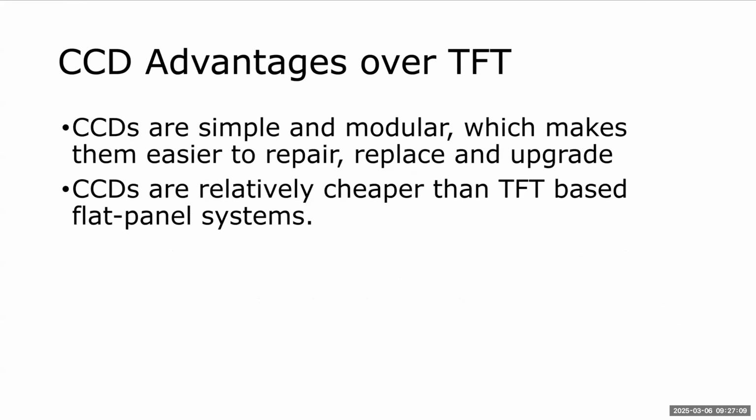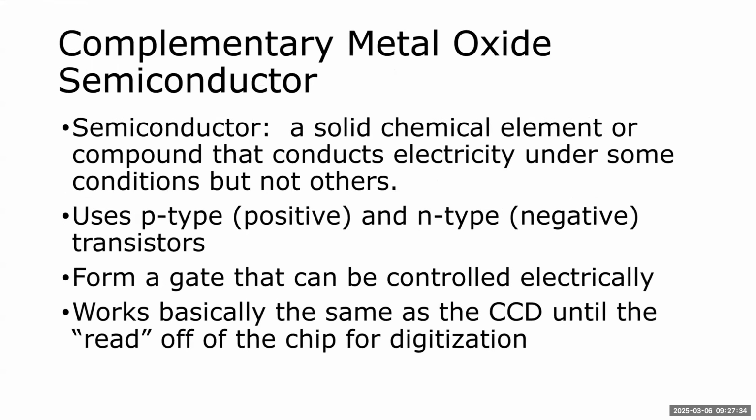CCD advantages over TFT: CCDs are simple and modular, which makes them easier to repair, replace, and upgrade. What that means is if you have a problem with your CCD type detector, there's a good chance it can be fixed, whereas with TFTs, if they go bad, you generally have to replace the whole thing. We actually had that happen a couple years ago in the lab. I can't remember if y'all knew about that or not.